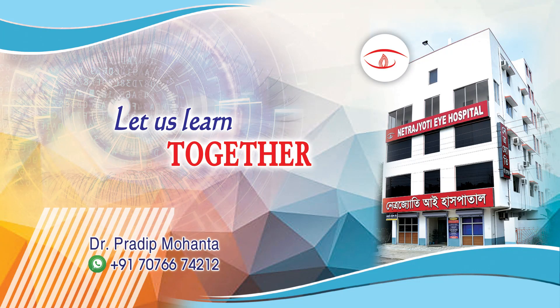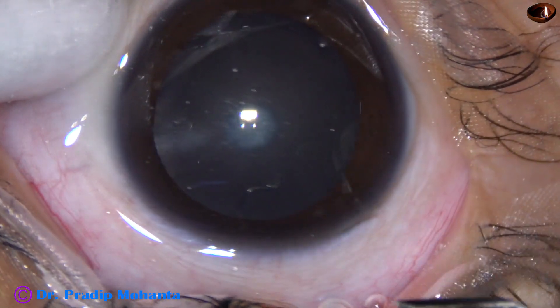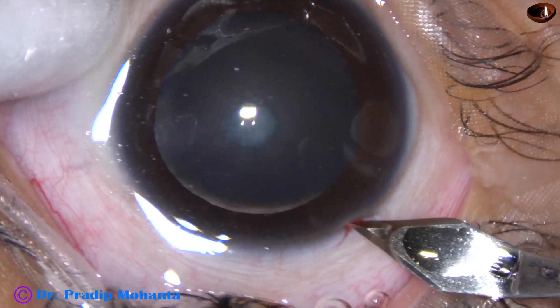Friends, welcome to my workplace at Ranaghat, West Bengal, India. This is a pediatric cataract. Let us observe this surgery.